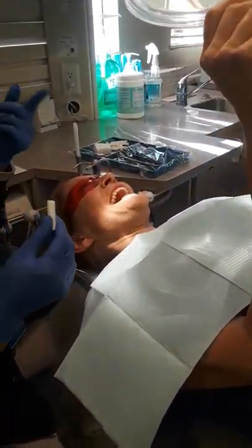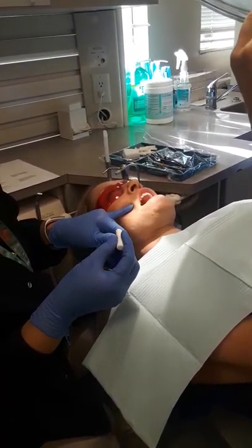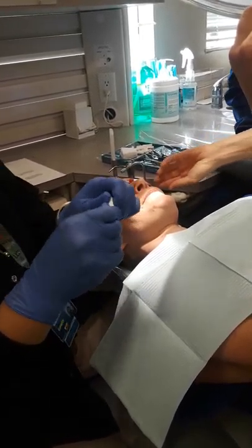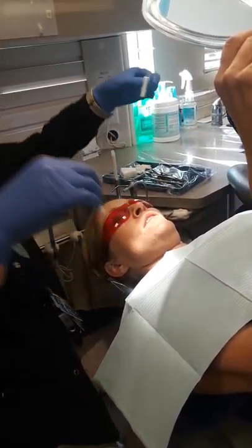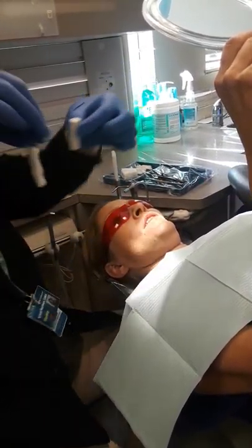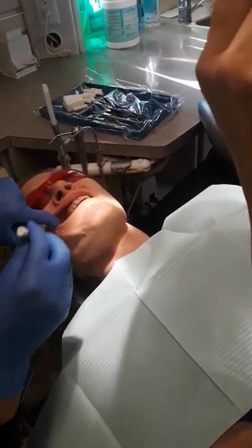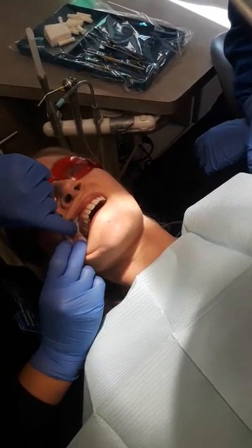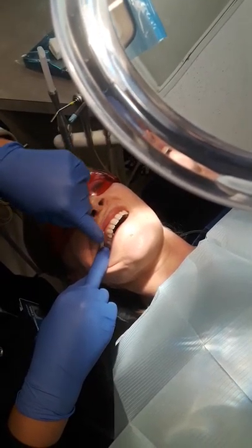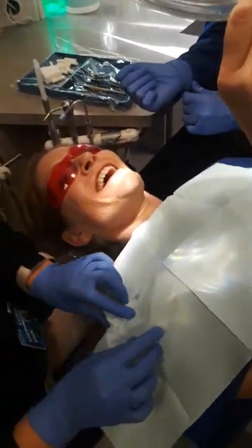First things first: it's one cotton roll for the maxillary, and you want to put that on the buccal. If we're working on just the upper right quad — let's say tooth number two, which is the farthest tooth in the mouth — I make these a little bit longer. I wiggle them out to make it long. I have my patient open but close just a little bit, because I want to put it on her cheek as much as possible. I aim for the cotton roll to be on tooth number two — it extends past the tuberosity, tooth number two is right there, and I extend a little bit further anterior. That cheek is now out of the way. Always retract the cheek to put in your cotton roll, and retract it completely.